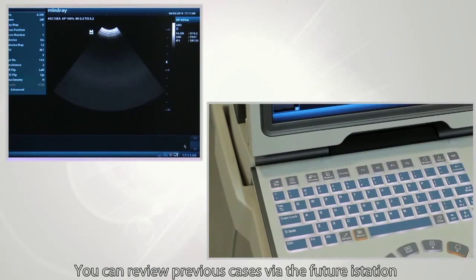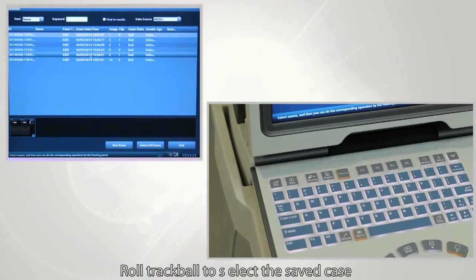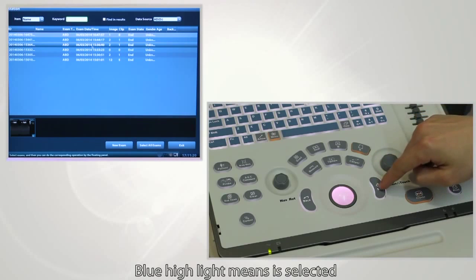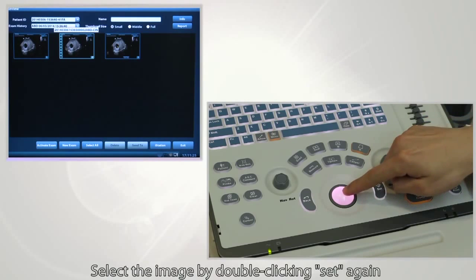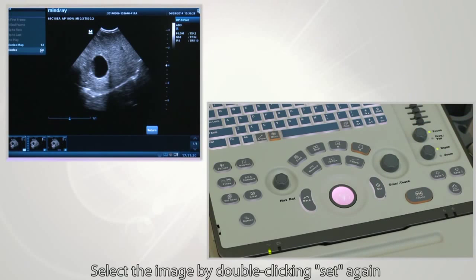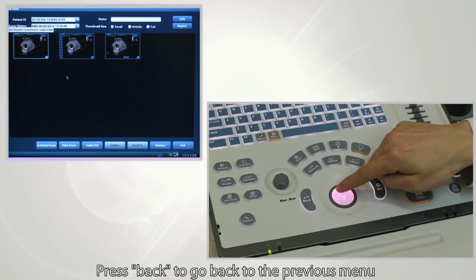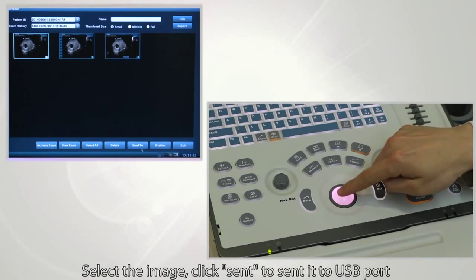You can review previous cases via the iStation feature. Roll the trackball to select the saved case — blue highlight means it is selected. Double-click Set to enter the case. Select the image by double-clicking Set again. Press Back to go to the previous menu. Select the image and click Send to send it to the USB port.